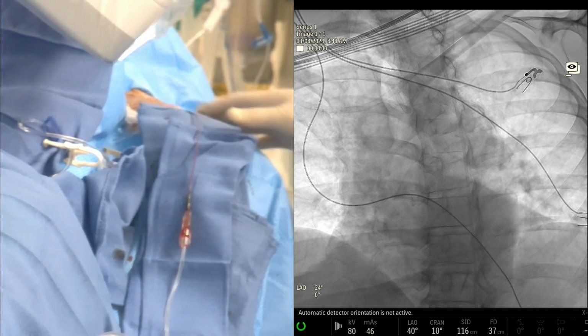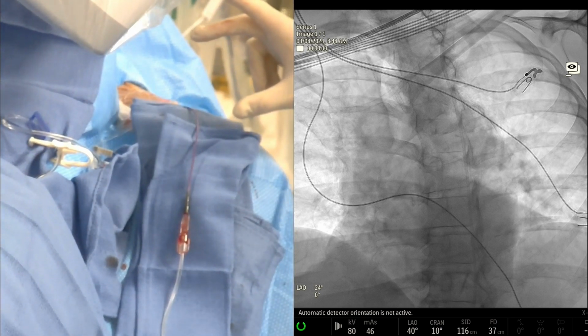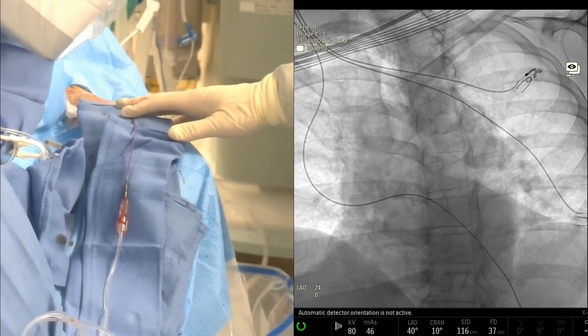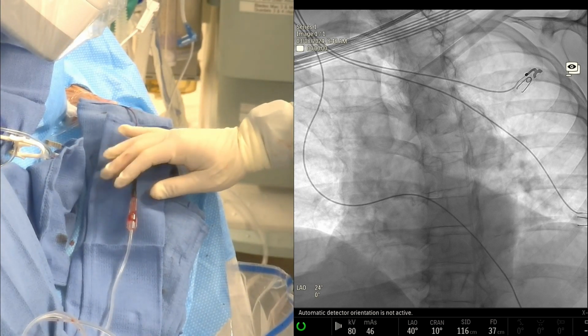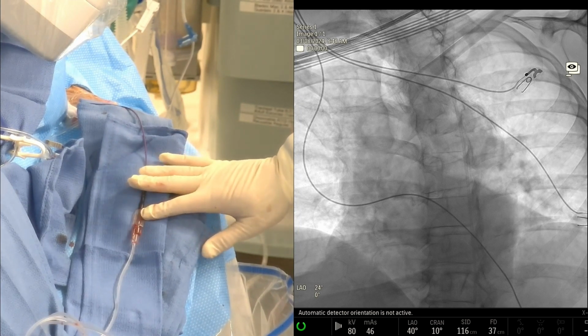We usually access a little bit higher on the wrist, approximately about that much higher than the styloid process, which gives us ample space to be able to get our diagnostic catheter pretty close to the prostate artery, which, as you'll see in a few minutes, is one of the key things, in my view, to getting very close and getting a quick cannulation of the prostate artery.